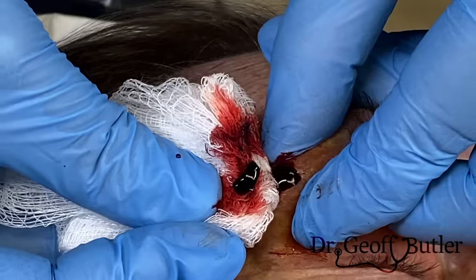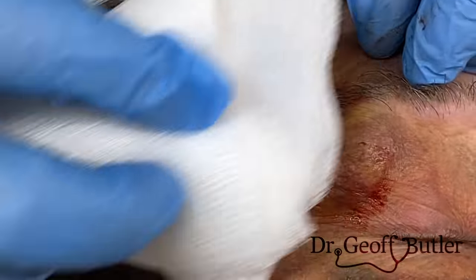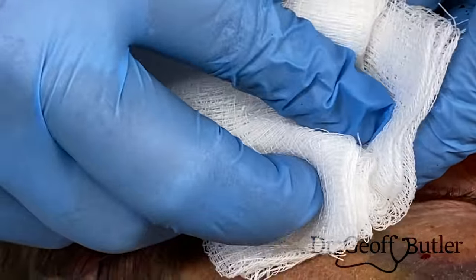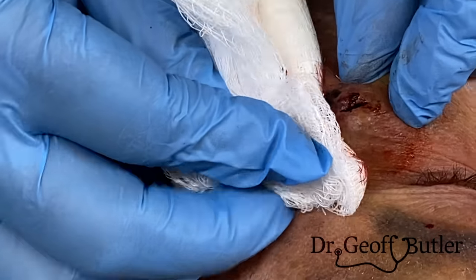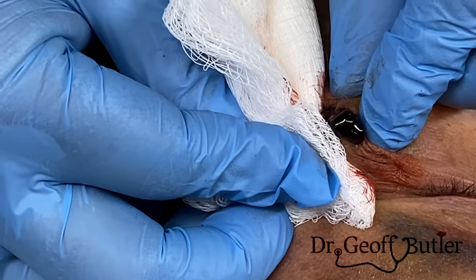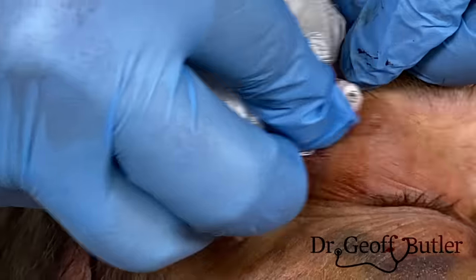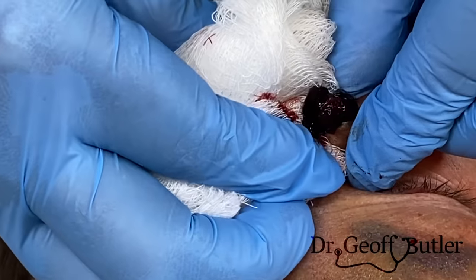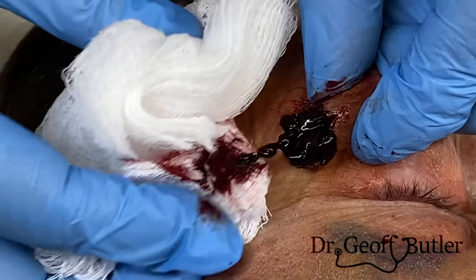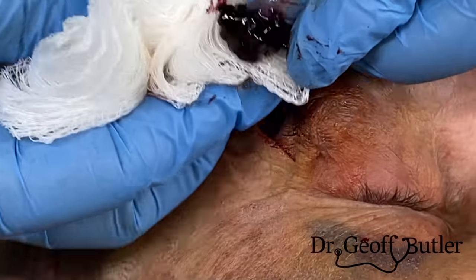See that clotted material? There we go. This is the balance between trying to see if I can get as much out as possible. Now you see that? That's what I wanted to get out. Just like with infected material, that's what we'd expect to get out there.